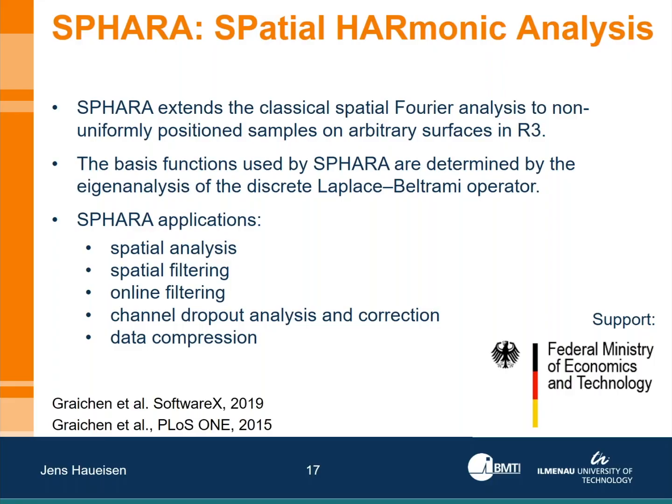So what can you do against this? Of course, you can use your typical signal analysis portfolio to go against the movement artifacts. But that sometimes is not sufficient. And when you have, for example, channel dropouts, you might want to also do a dropout correction. And this is what we do here with a technique called SPHARA, spatial harmonic analysis.